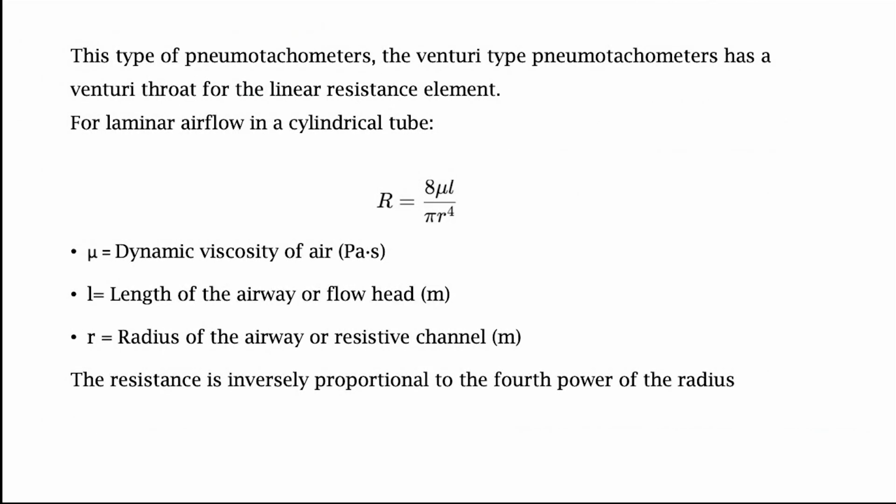And so in this type of pneumotachometers, in particular, there is a type called Venturi type pneumotachometers. Find out what this Venturi pneumotachometer is. There is such a thing called the Venturi effect, and a Venturi throat or Venturi type design. What is this Venturi?